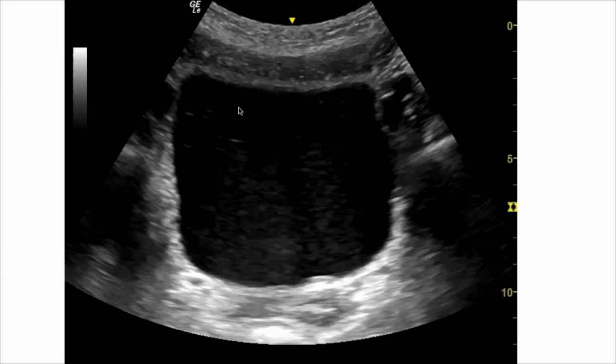You can also see a more excessive plate elevation in an individual when you're assessing pelvic floor contraction in the standing position. And then you also see a levator plate depression. This occurs commonly with individuals who can actually do a pelvic floor contraction, but due to an increase in intra-abdominal pressure and almost a Valsalva maneuver, you'll see a depression of the bladder, and this can be a neuromuscular control issue, or it can just be a difficulty contracting those muscles and the fascia around that pelvic floor to hold it.